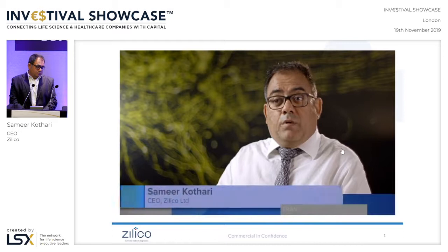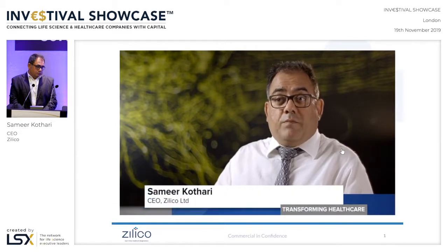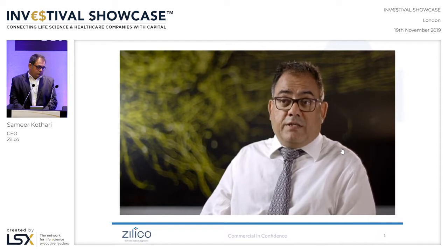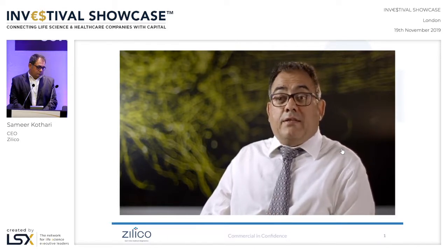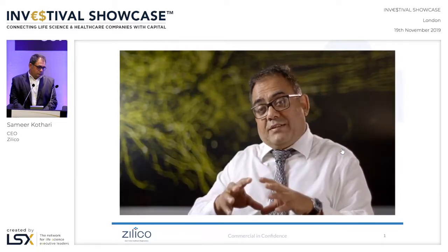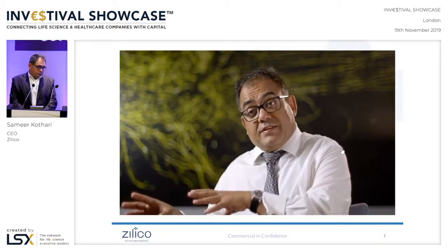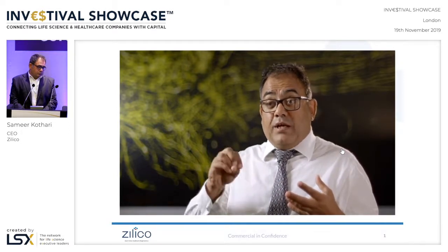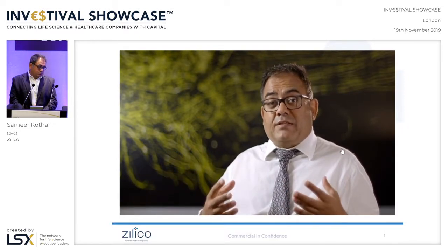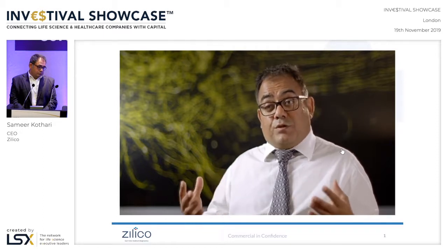Many diseases are still visually diagnosed, and clinicians are pretty good at that. But as you're trying to prevent diseases earlier, it becomes more challenging to find disease for clinicians visually. And this is where we come in. As disease moves from normal into early precancer, late precancer, and then invasive cancer, the properties of cells and tissue change. Equally, the electrical properties of those tissue and cells changes. And you can measure that. And the way you measure that is a technique known as electrical impedance spectroscopy.